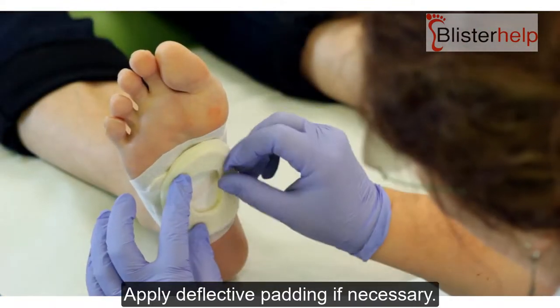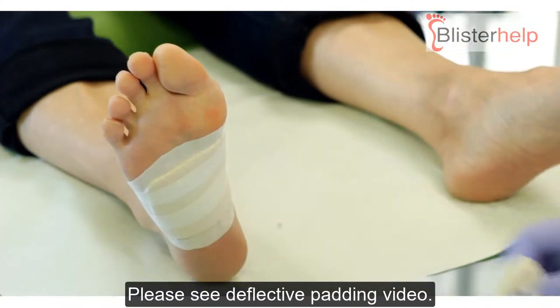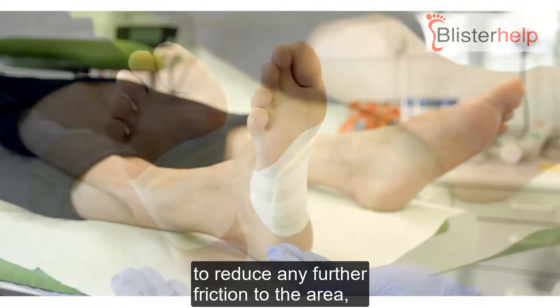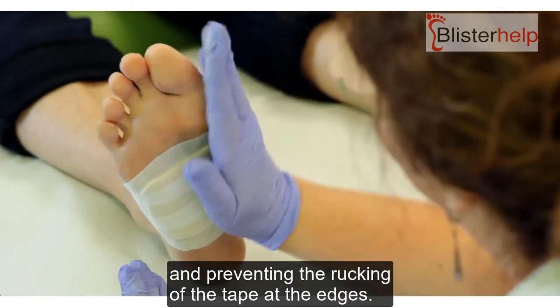Apply deflective padding if necessary — please see the Deflective Padding video — and then use Two Toms Blister Shield powder to reduce any further friction to the area and prevent the rucking of the tape at the edges.